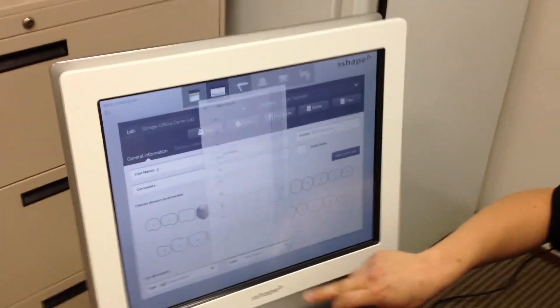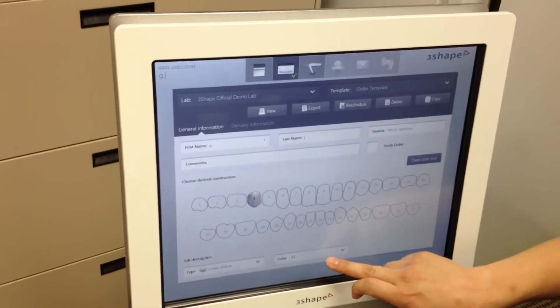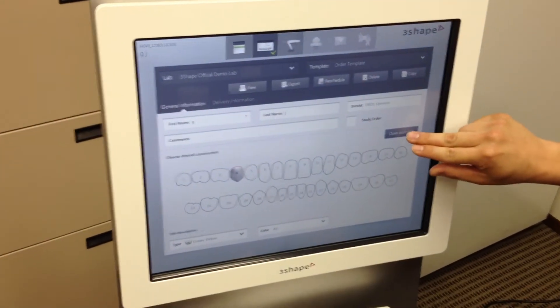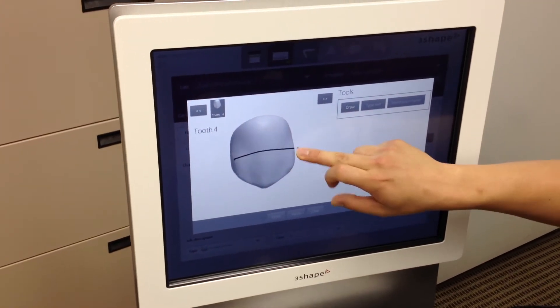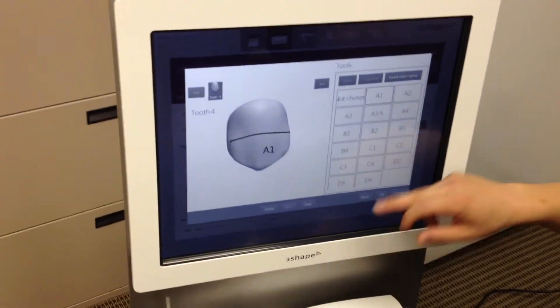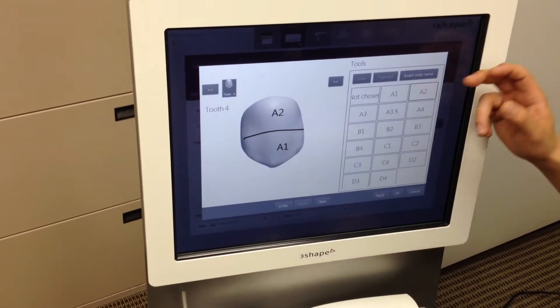For color, you go ahead and choose your shade over here. I'm just going to say an A1 shade. What's nice as well is if you have a two-color crown, you can go ahead and open up a color tool right here. I'll hit this draw button and insert the color name — say I want an A1 incisal and an A2 gingival — and go ahead and add it in just as is.